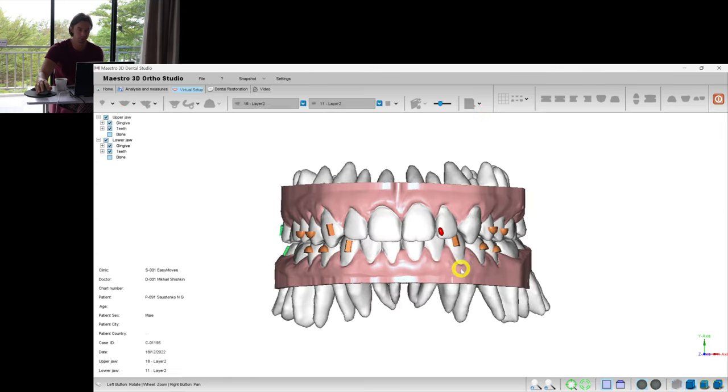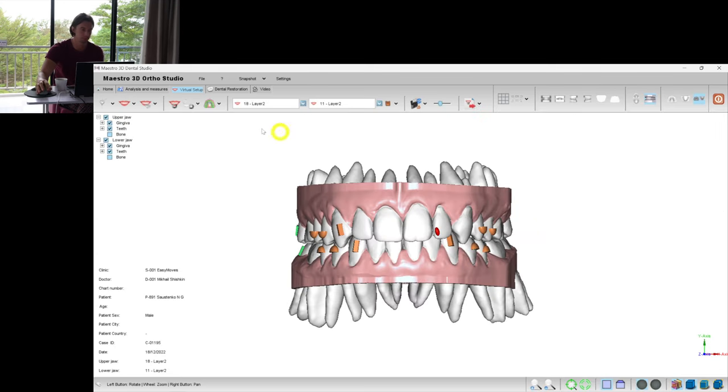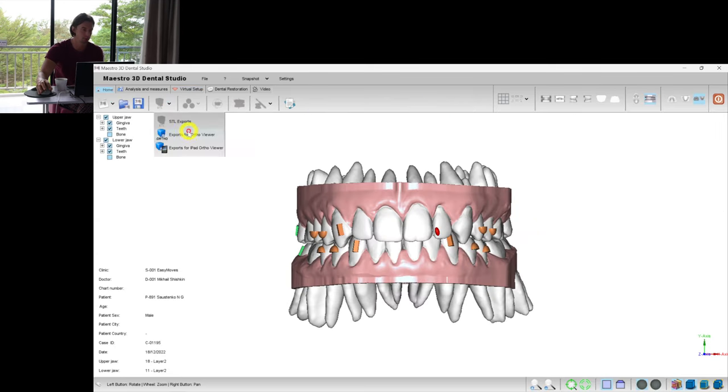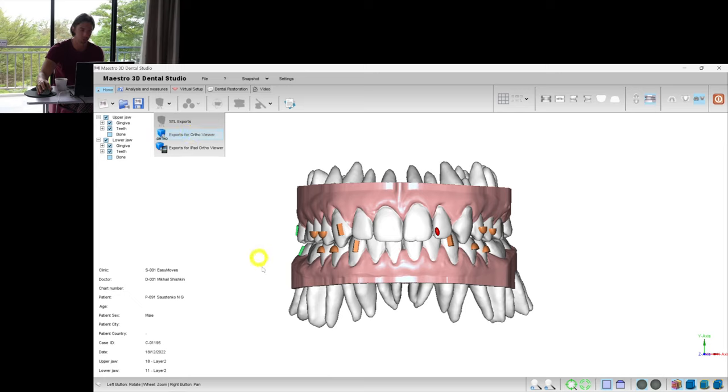And now we're satisfied with the final result, with the quantity of aligners. And we can export the project to show it to the patient and to the doctor.